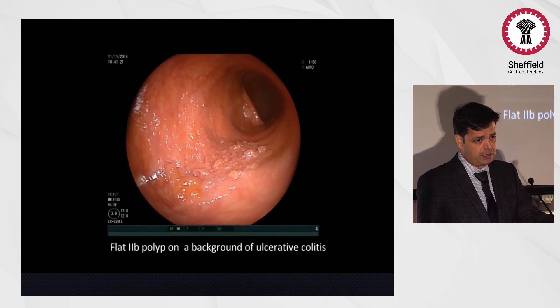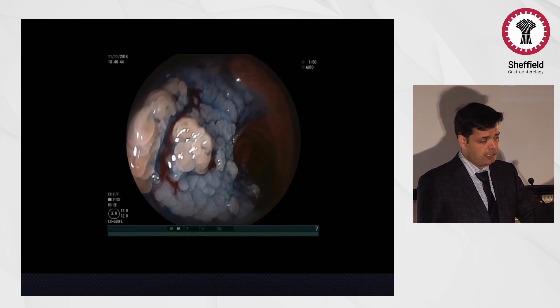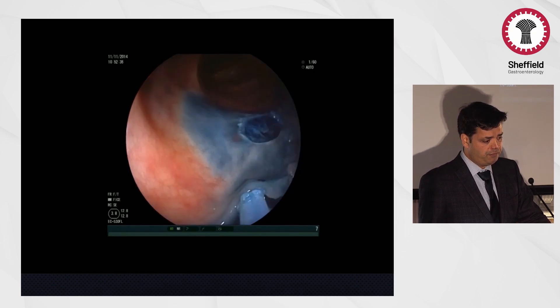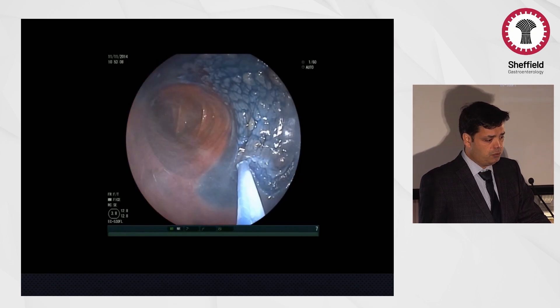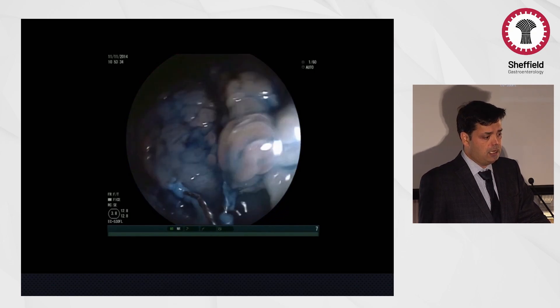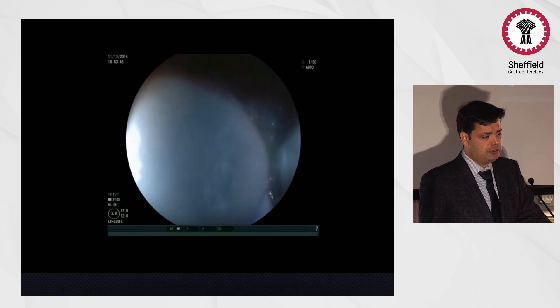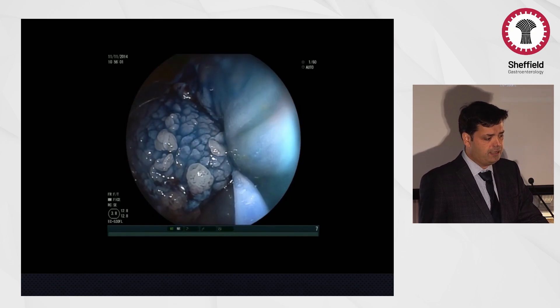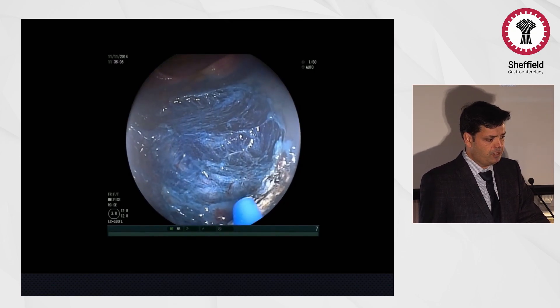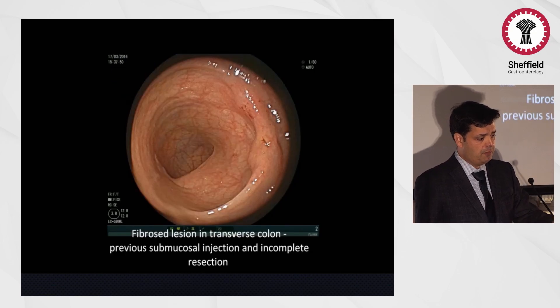This technique is also useful for a background of colitis with a scarred lesion. It lifted but was difficult to engage the snare and resect. I'm just using the tip of the snare to make a bit of a groove around the lesion — not completely, only partly — and then using the snare to engage it there and suck it. It's useful in scarred, very flat lesions like this. A bit of APC on tiny fragments, and you can see there are areas where I had to use the tip of the snare, but it was completely resected.